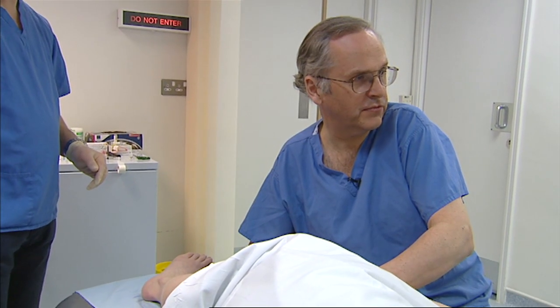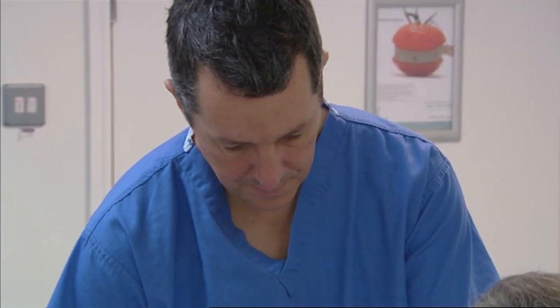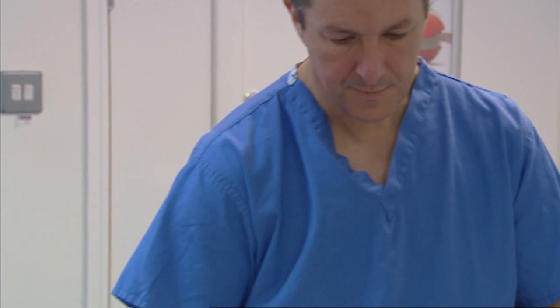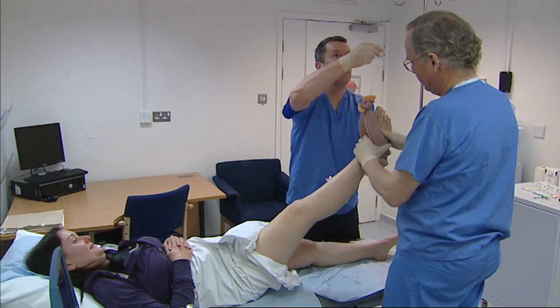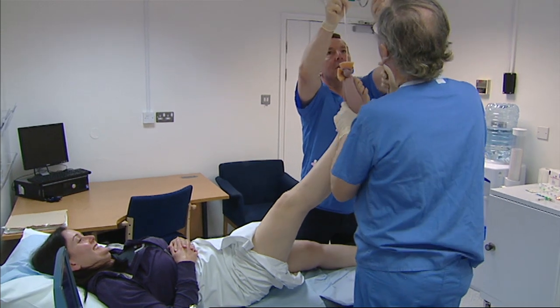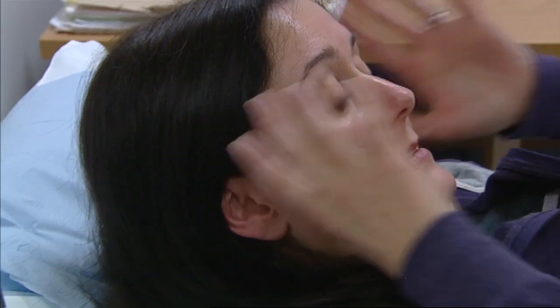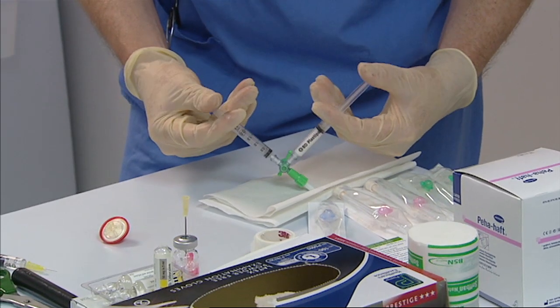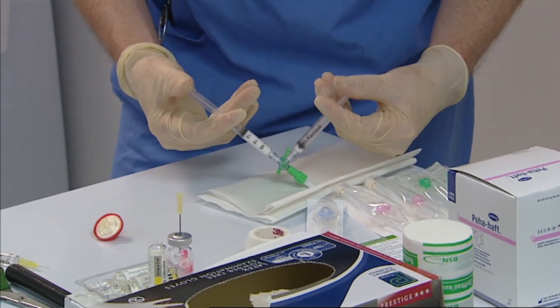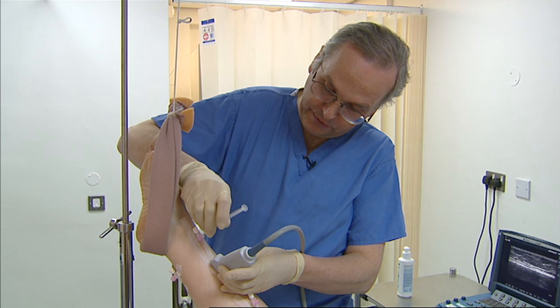We inject some saline and again we're in the vein there. The purpose of elevating the leg is to minimise the amount of blood in the veins we're going to treat. Blood has been shown to inhibit the effect of the foam — it is in fact extremely powerful at stopping sclerotherapy working. So elevating the leg makes the veins much smaller and facilitates the treatment.